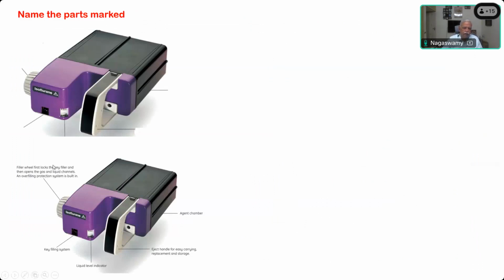So only five parts. This is the actual chamber to contain the amount of liquid agent that you use. This is the handle for insertion as well as exit of the cassette into the machine. And this is the filler wheel which you have to rotate to insert this key filling system, and then you can visualize the level of the liquid in this.